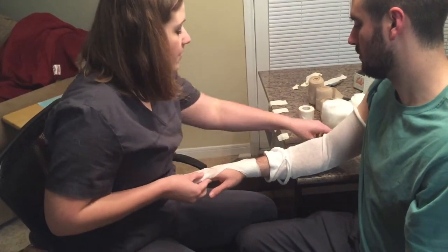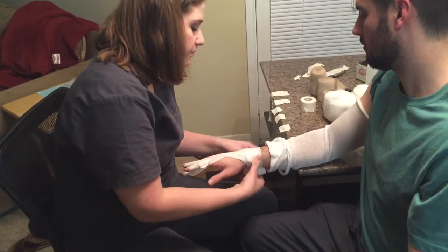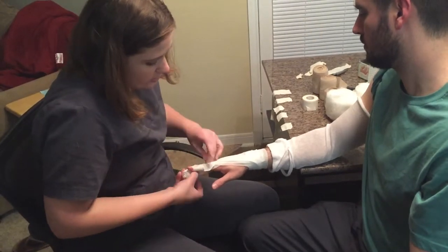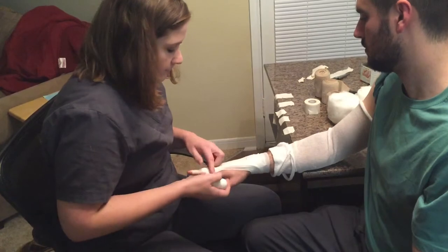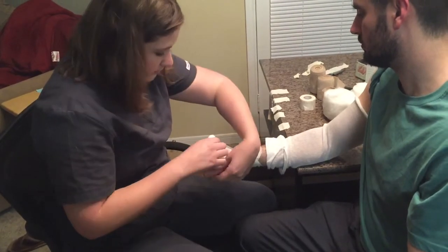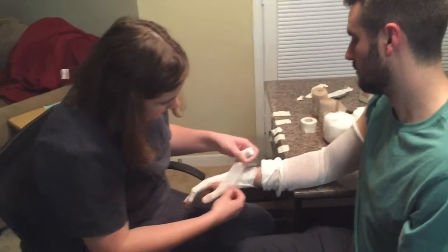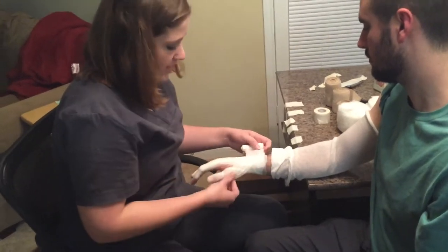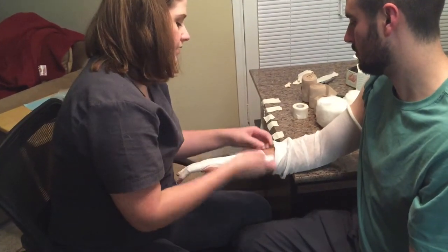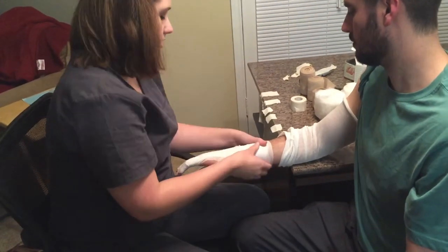So this bandage ended right here. I'm going to go ahead and start with another one. Do the same thing — anchor it up here, go back down, and recover that so it doesn't unravel. See how I did that? Then do your thumb — same process. I ended the bandage. You never want to end the final bandage on your fingers. That worked out good and your palm's clear. With this remaining bandage, I'm just going to wrap this up the rest of your arm, just kind of loosely.